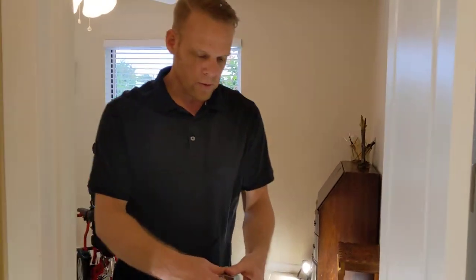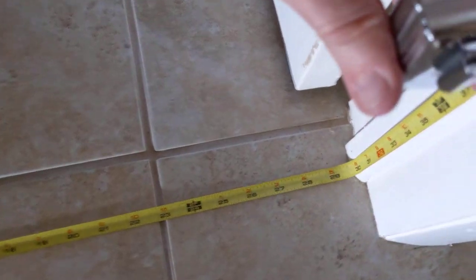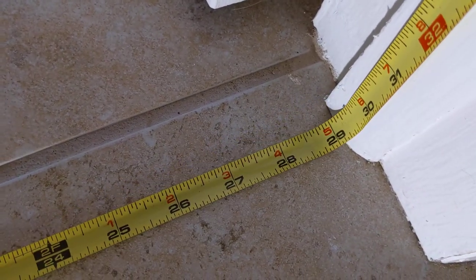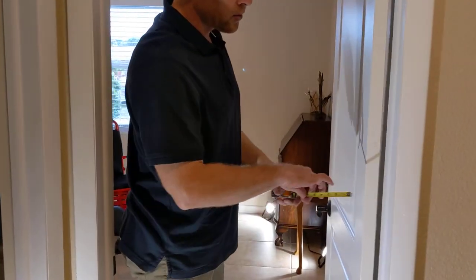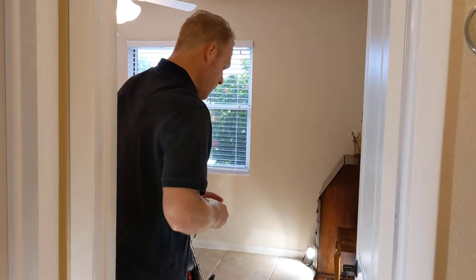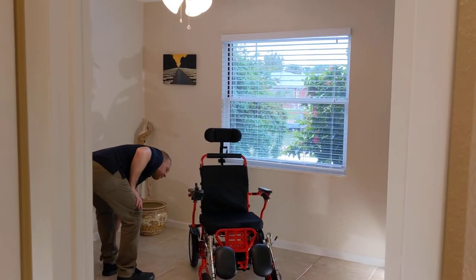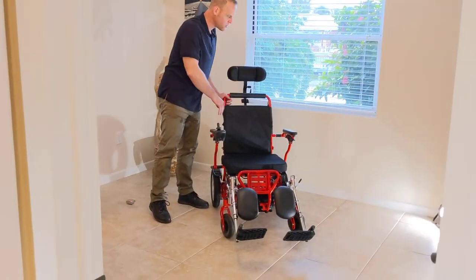Now this door here, let's take a look at this. If we take a look in between the thresholds here, we've got about 29 inches. And if we take into consideration we've got a door, it's about another two inches. Cutting in pretty close. We have maybe about an inch and a half of space that we can navigate, and we have a leg extension kit on this chair as well.